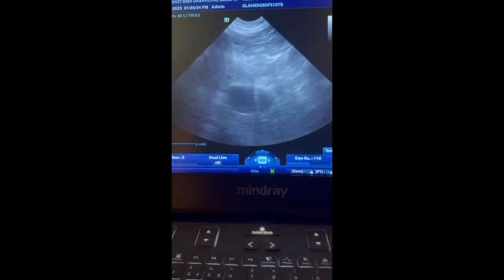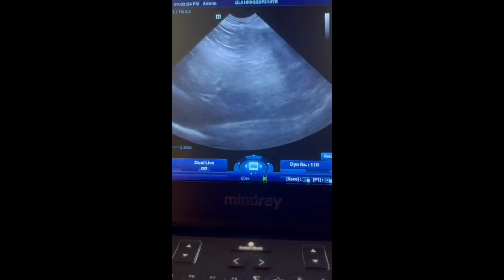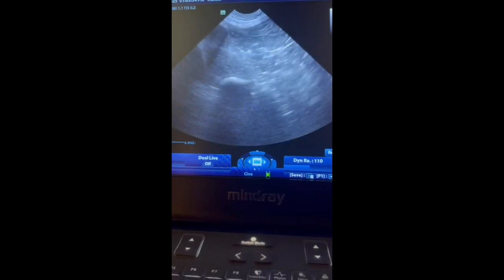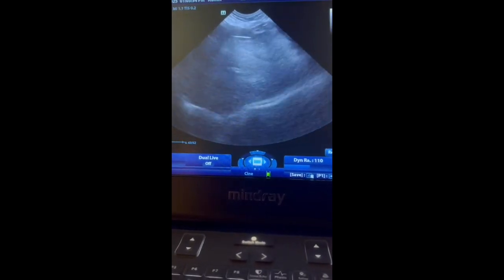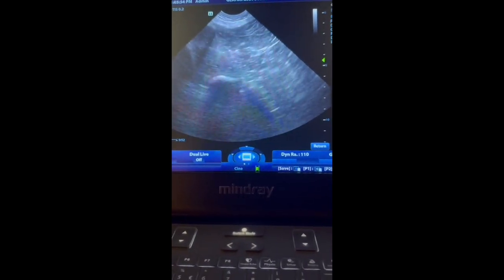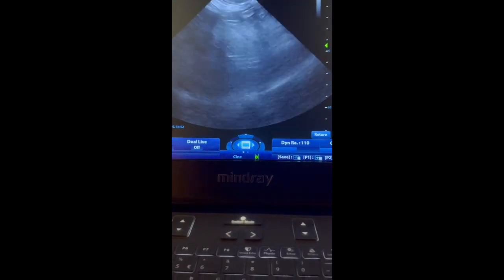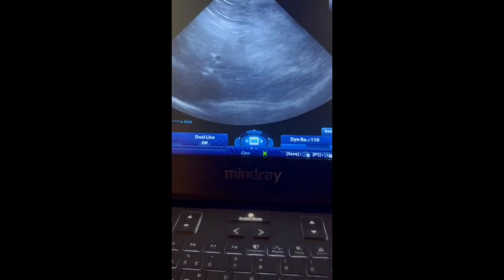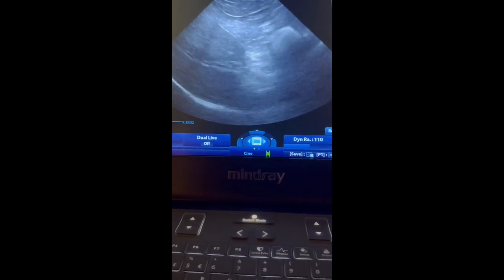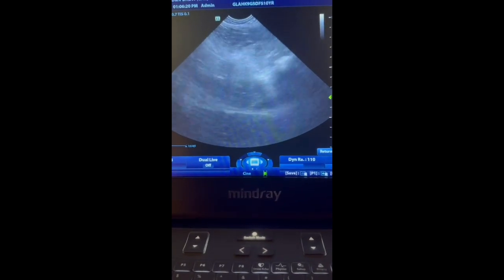Okay, I'm doing this live now because it's a bit different than on the computer off of Telemed views. But this is an upper model that's a bit more recent than the ones I showed on the computer. If we're looking at resolution depth live, and if you look over to the right here, there is 10 centimeters, right? And so I'm looking at the resolution depth, and I have down to the diaphragm and the gallbladder. And so my resolution is pretty solid at 10 centimeters.